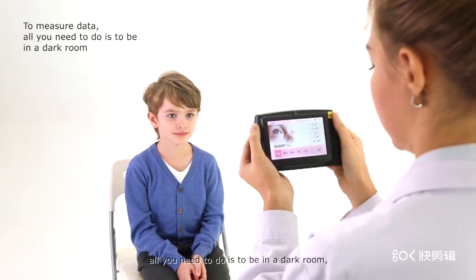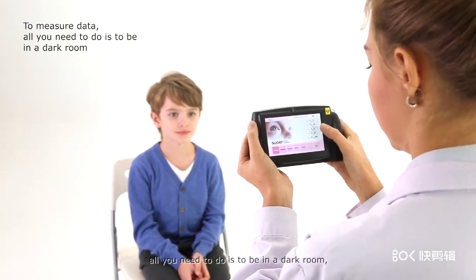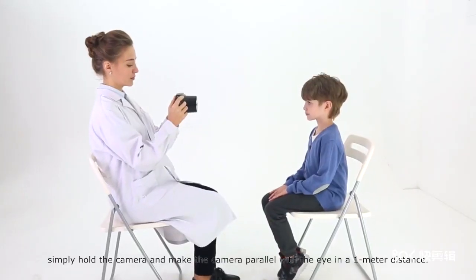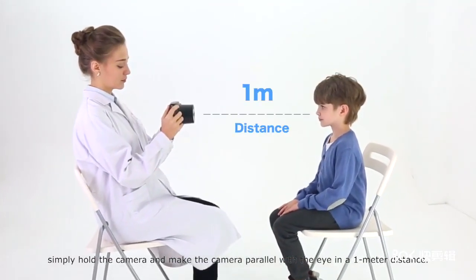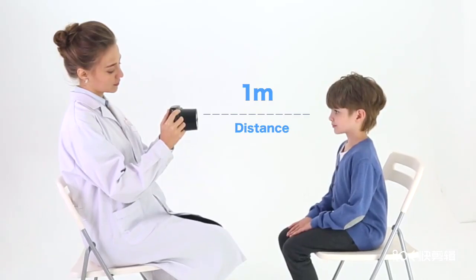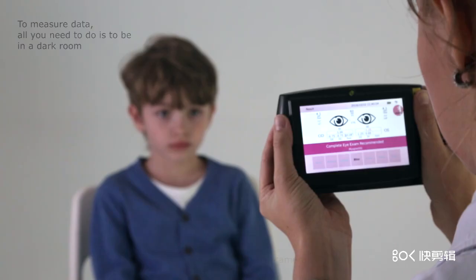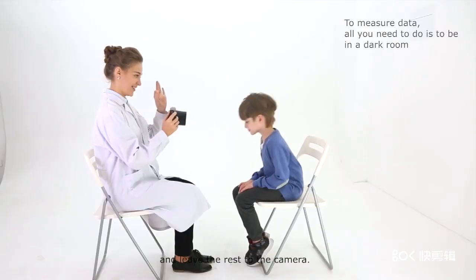To measure data, all you need to do is to be in a dark room. Simply hold the camera and make the camera parallel with the eye at a 1 meter distance. Choose the age range on the interface, follow the instruction, and leave the rest to the camera.